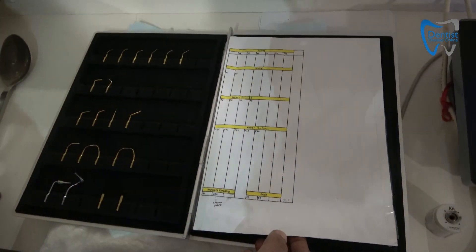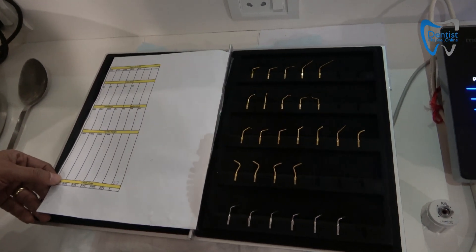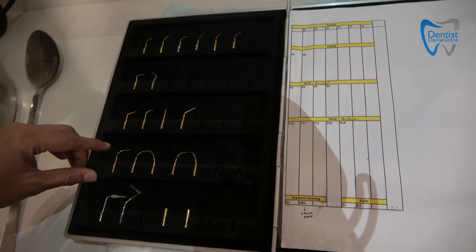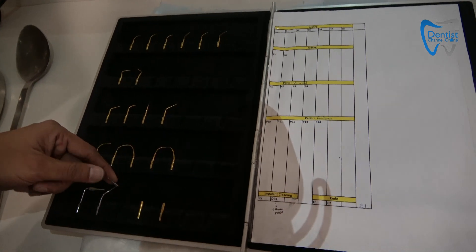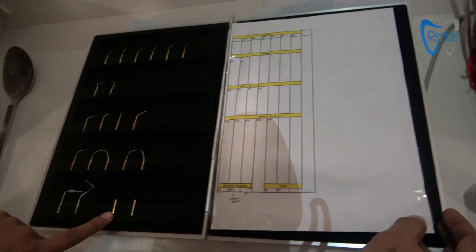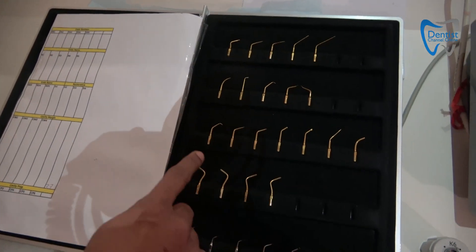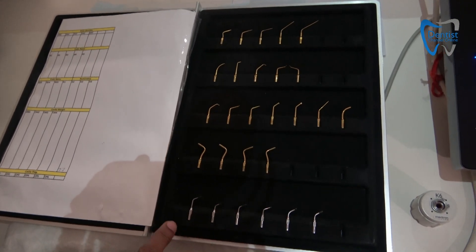Mectron multi piezo touch. So these are your scaling tips, these are for your perio, this is for your perio anatomical, this you can do your implant cleaning, your crown preparation, this is for your endo tips where you can attach your endo files. Here you have your endo revision, endo-retro, retro tips, restorations — these are for your cavity margin and these are for your cavity preparation.